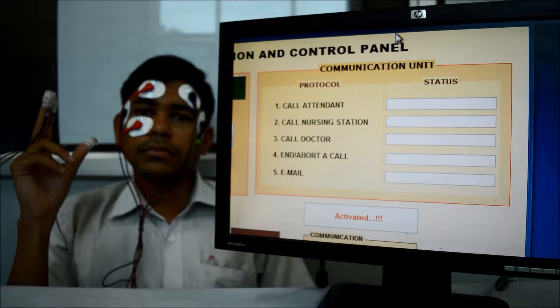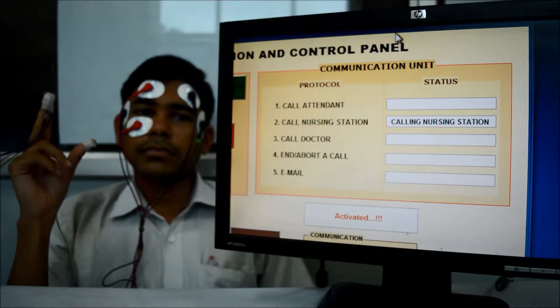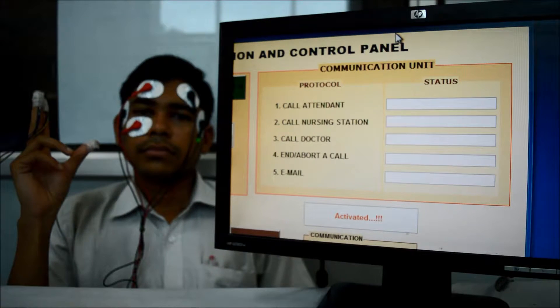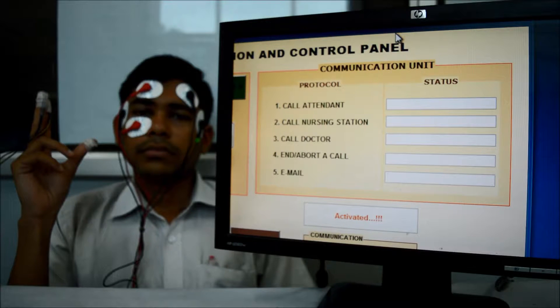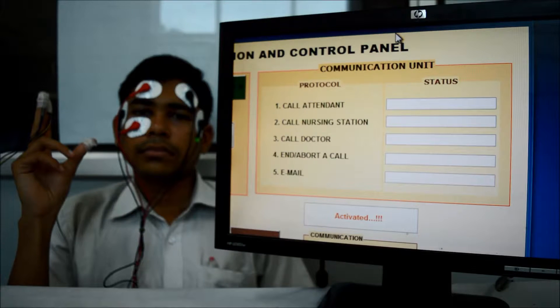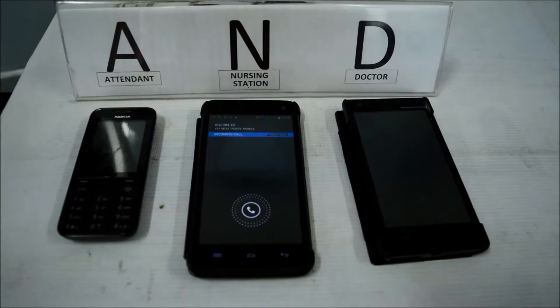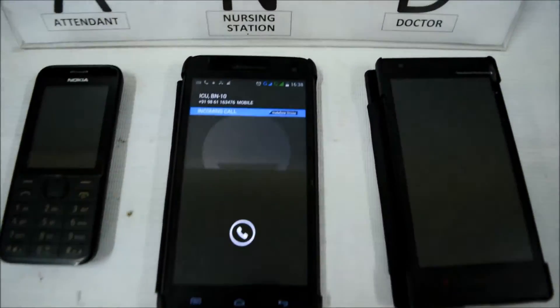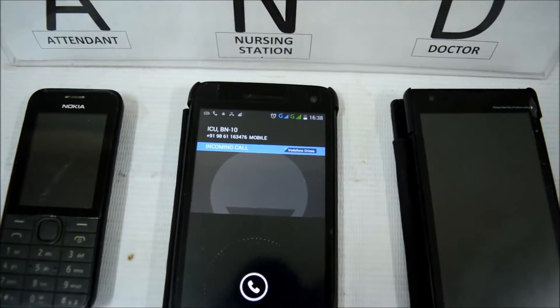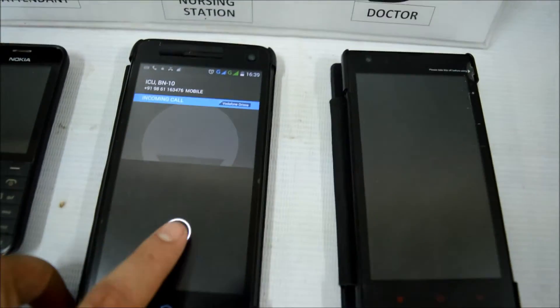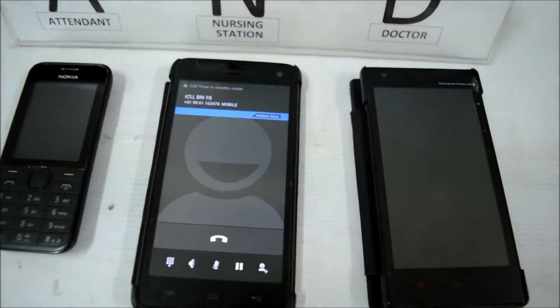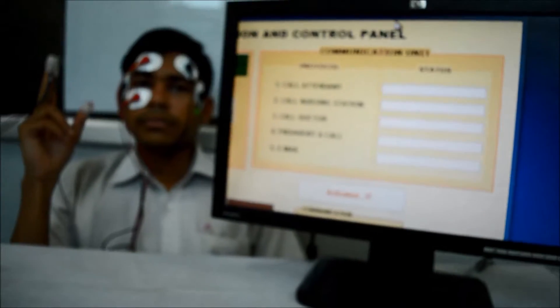Next. Call nursing station. Now the call to the nursing station has been initiated. Connected — here you can see the nursing station mobile is ringing.